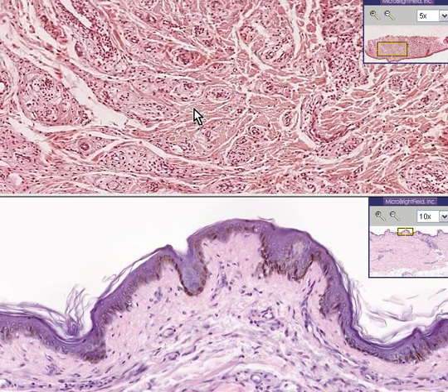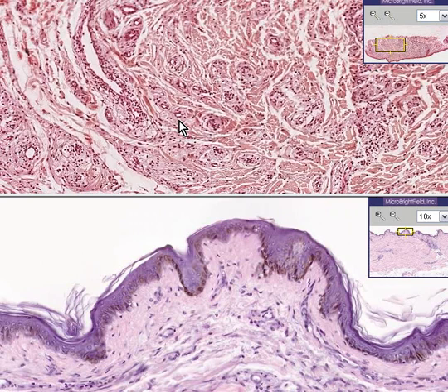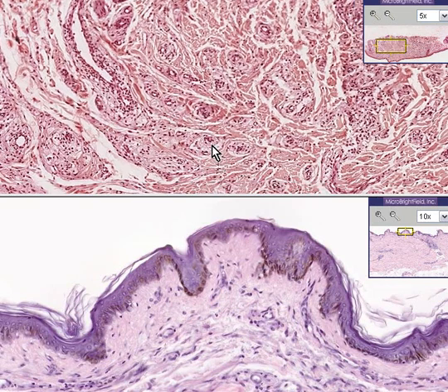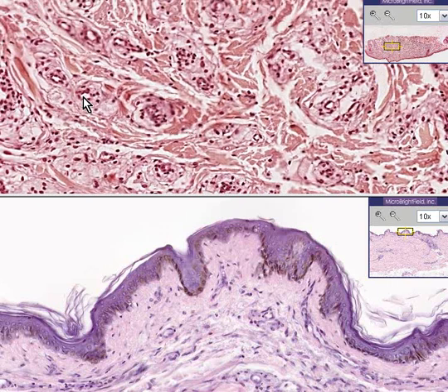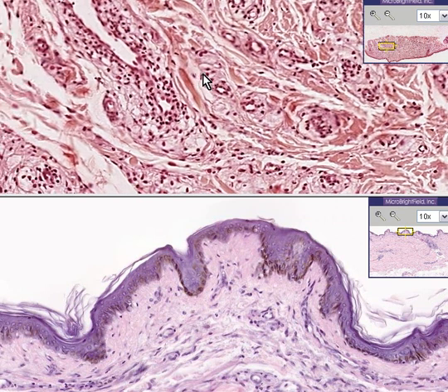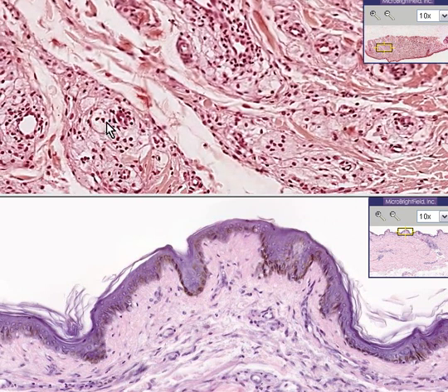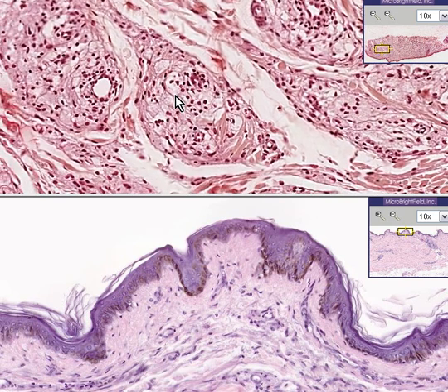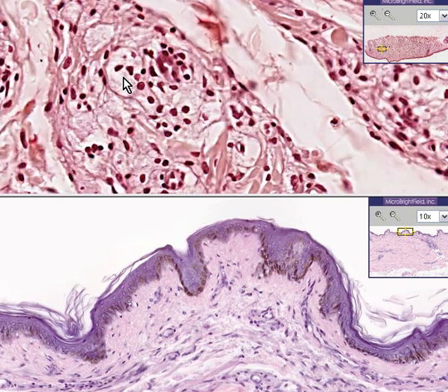Let's look at the dermis. It does not have uniform bands of dense fibrous connective tissue. It has these little whirly areas of cells surrounding blood vessels, but also freely little globs of cells in which the cytoplasm is very foamy and filled with some foamy material.